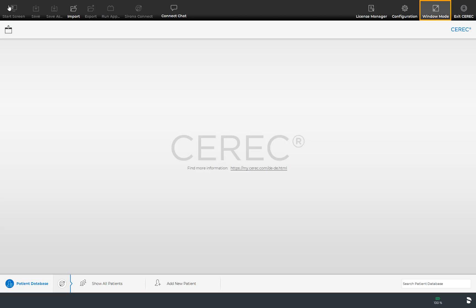By turning on the window mode you will exit the full screen mode of the CEREC software so that you can access your taskbar, for example. Now we take a detailed look at the submenu configuration.